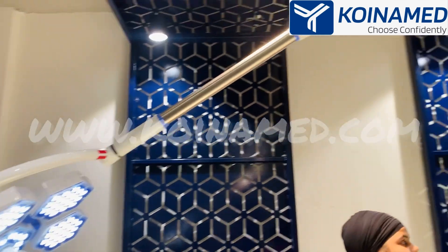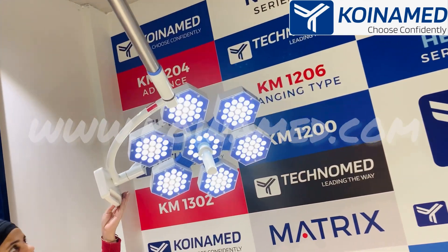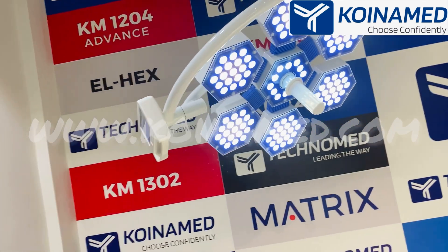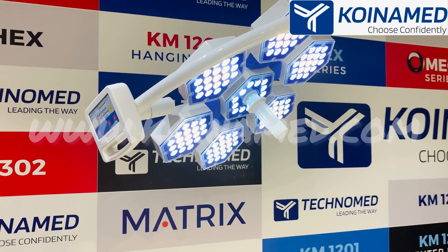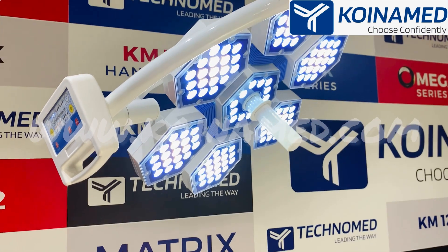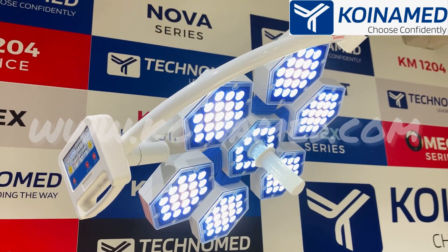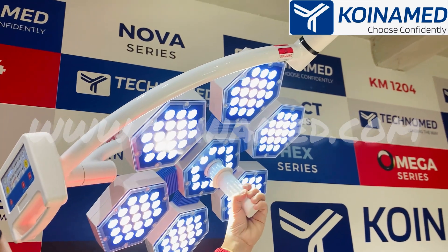The second dome has the same features — it also has 126 LEDs from Osram made in Germany. The same combination of yellow and white LEDs is used, and a high quality sterilizable handle is provided in the middle for adjusting the focus.